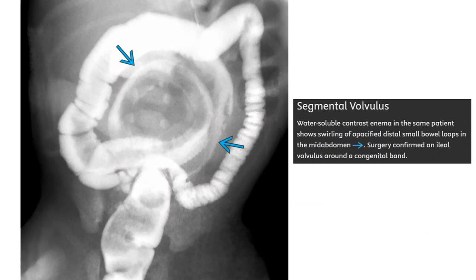Water-soluble contrast study in the same patient shows swirling opacified dilated small bowel loops in the mid abdomen. Surgery confirmed an ileal volvulus around a Meckel's diverticulum.